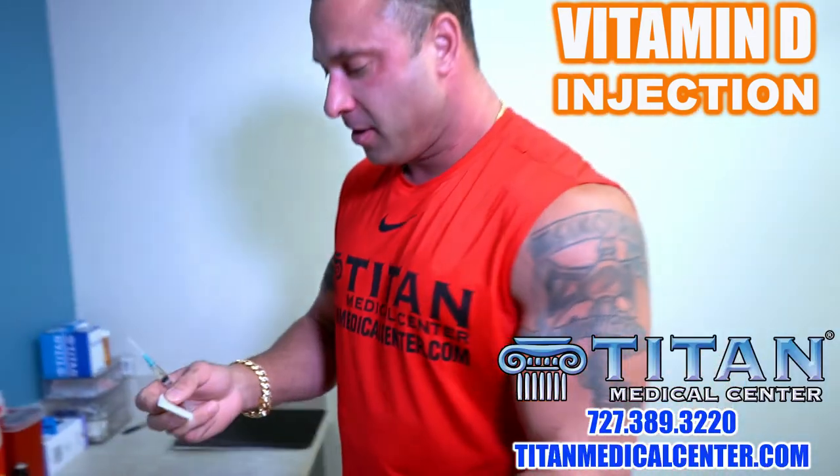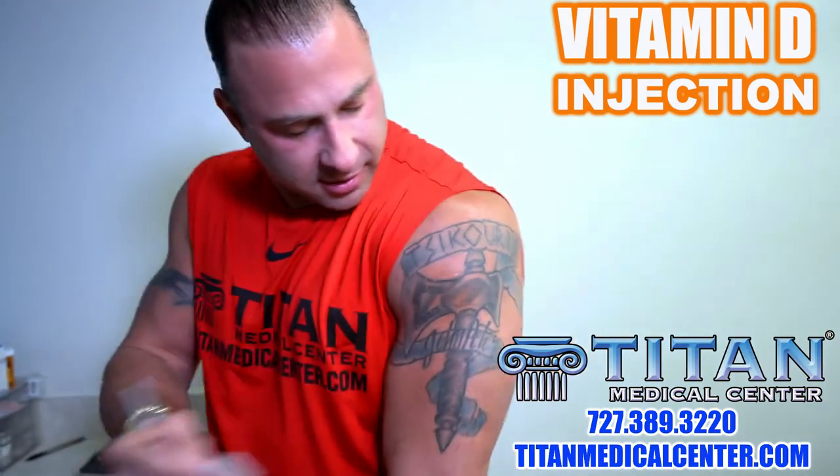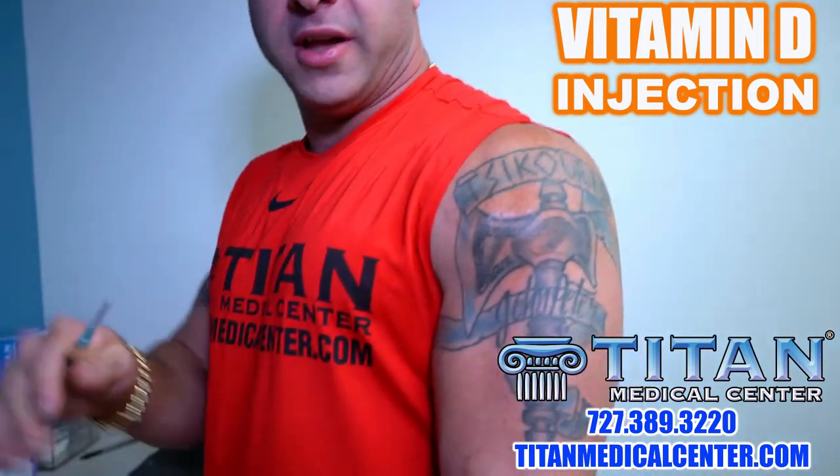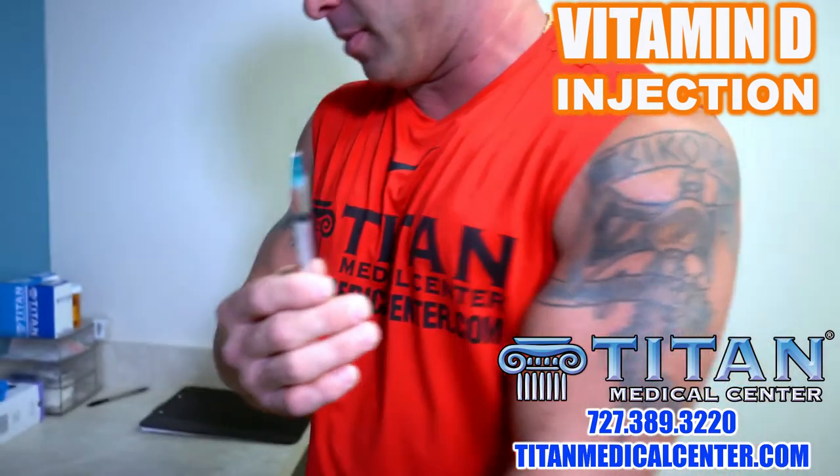Cleanliness is next to godliness — we're going to cleanse the site, going back and forth two or three times. Site is cleansed. Now, don't inject right away after you clean the site. Give it at least 30 to 60 seconds to let the alcohol dry. If you inject while the alcohol is still wet, you can push it inside and it might create a burning sensation — it won't hurt you, it just might sting a little.